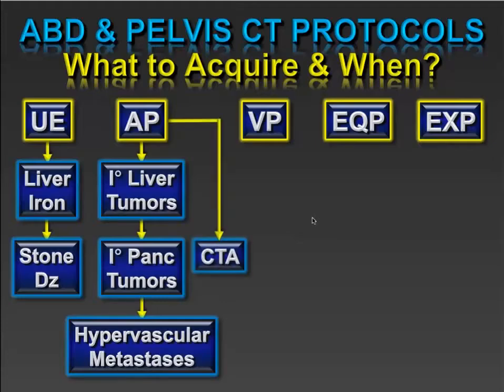We won't specifically talk about CT angiography. It's one of those indications, however, where we may only acquire images during the arterial phase, which is somewhat unique. Most applications that we do include both an arterial and a venous phase, and the contrast media parameters are a little bit different when you're looking only at the arterial phase, and we'll talk about that. Almost all the protocols we'll discuss do have a venous phase, and that's pretty important.